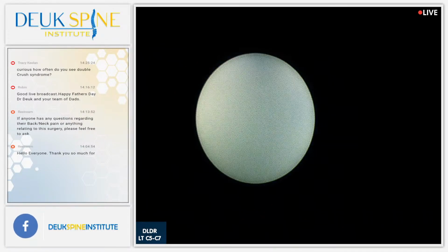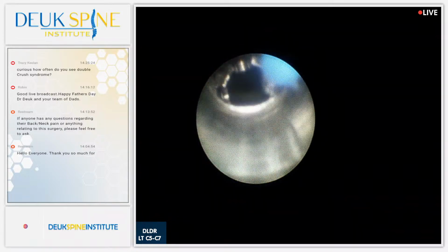Just about done with this one disc. Just floating out a few pieces of herniation.